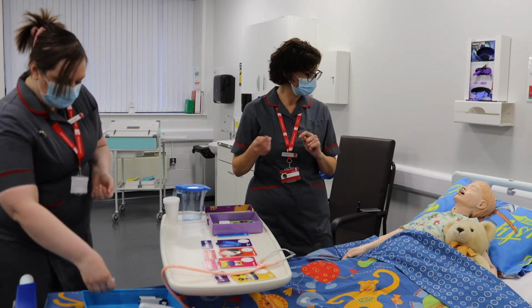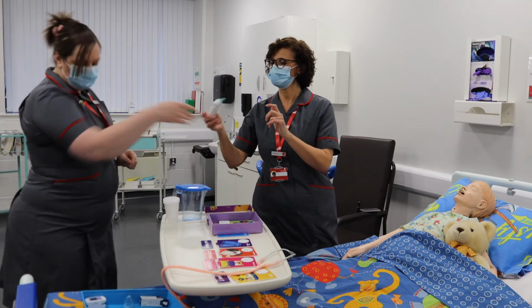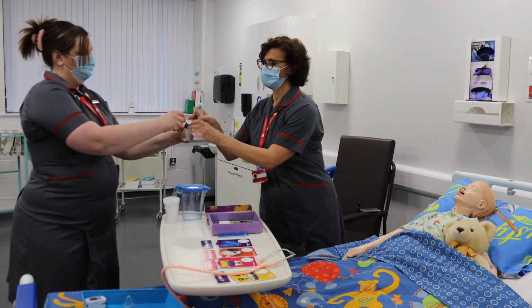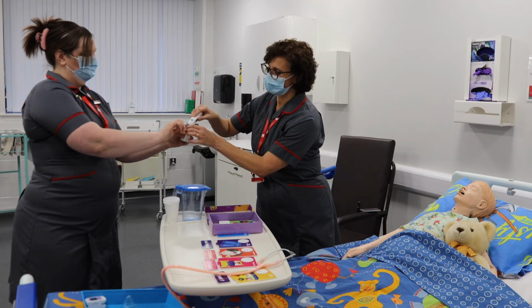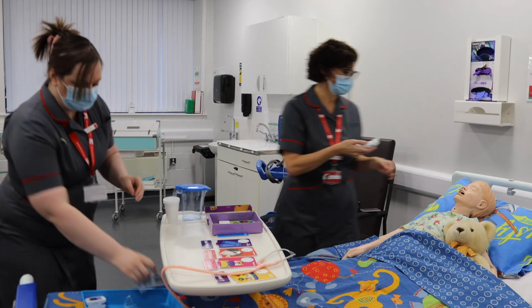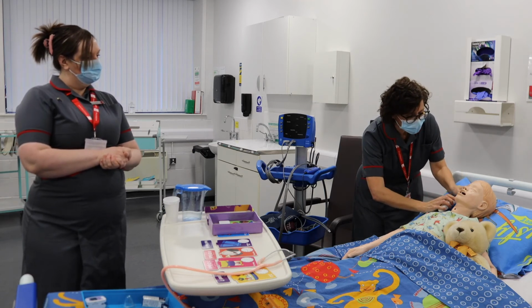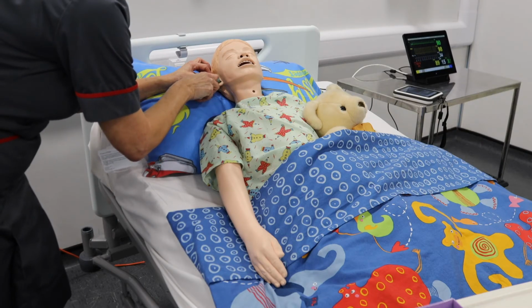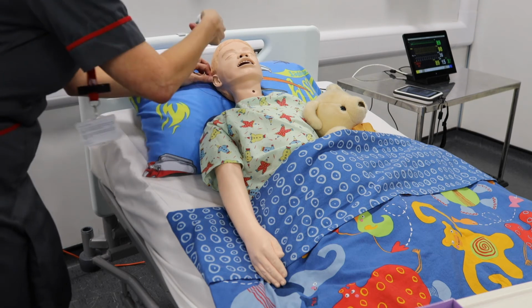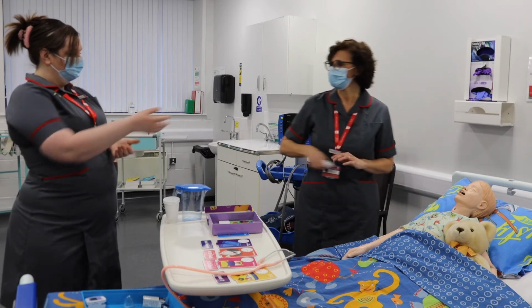Thank you. And then finally, just for now, I'd like to do Sam's temperature. There's some probes there. Thank you. A lot of you will have had these temperatures done on yourselves. I know I've got one of these at home for me as well at the moment. So I'm going to turn it on and I'm going to pop this in Sam's ear. Sam, I'm just going to take your temperature, okay? Just going to see how warm you are. Won't take long. Okay, that's beeped and that's come up that Sam's temperature is normal, so that's good. Lovely, thank you.